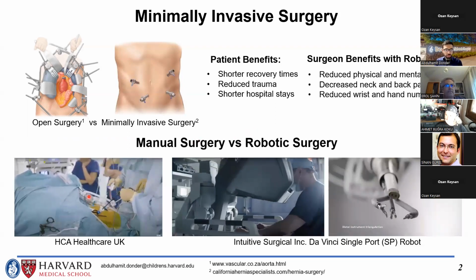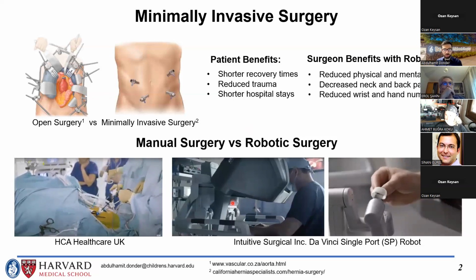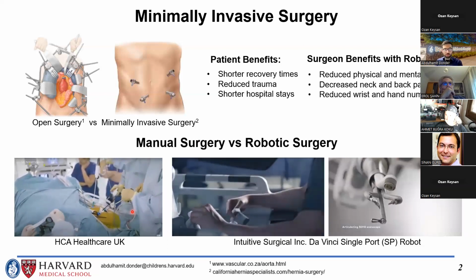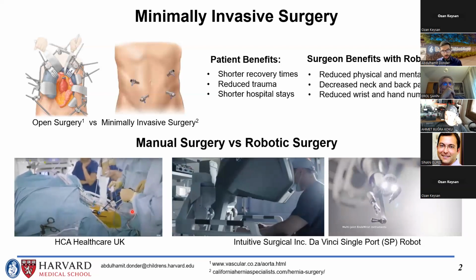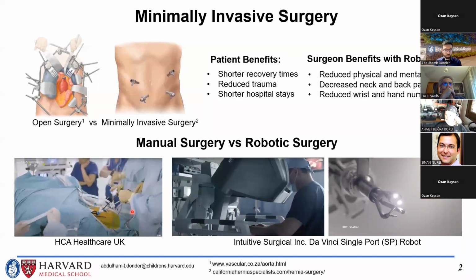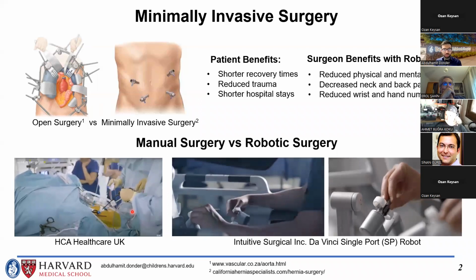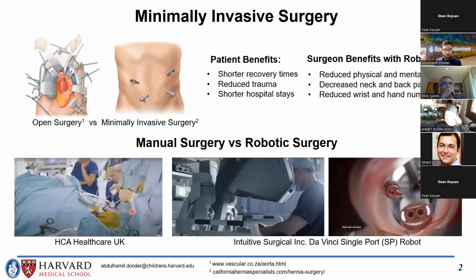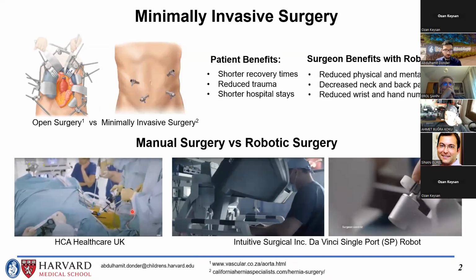And it could be conducted manually or using robotics, as seen in these laparoscopy examples. Here in this manual example, the medical instruments are inserted into the abdomen of the patient through small holes. However, clinicians mostly need to stand in uncomfortable postures during long operations. This could cause physical and mental stress, neck and back pain, and numbness in their wrists. Also, using these instruments is often very unintuitive to control.